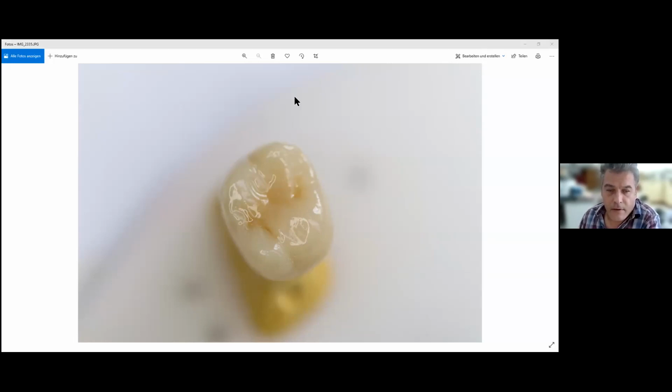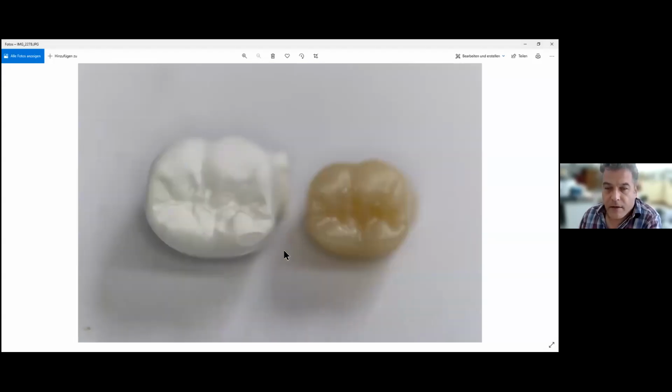And for the flexible denture, I don't have a photo now, but I can show you something else. For example, a zirconia crown that we milled from a multi-layer block, and after sintering, you can see it becomes a tooth shade, a little bit smaller because of sintering, but in this case, you just try the fit, and you're good to go.